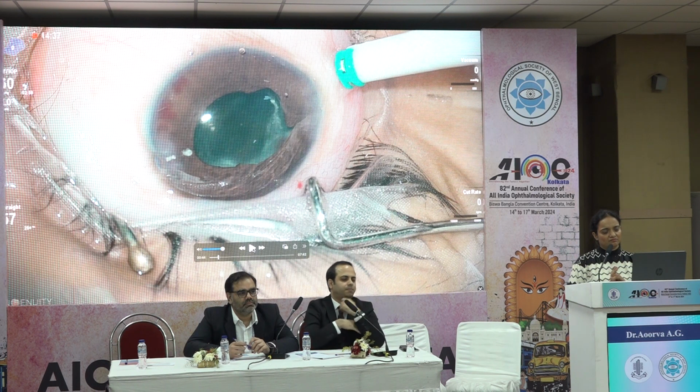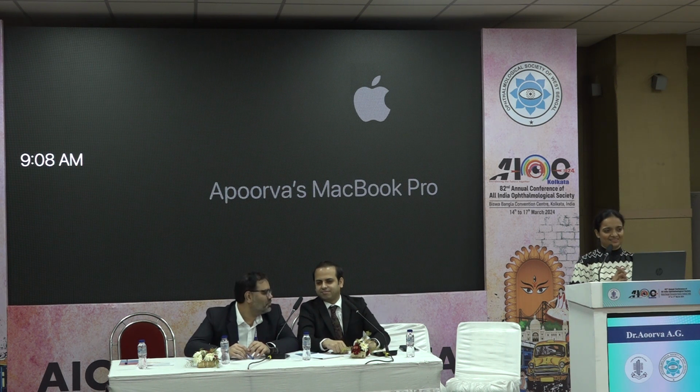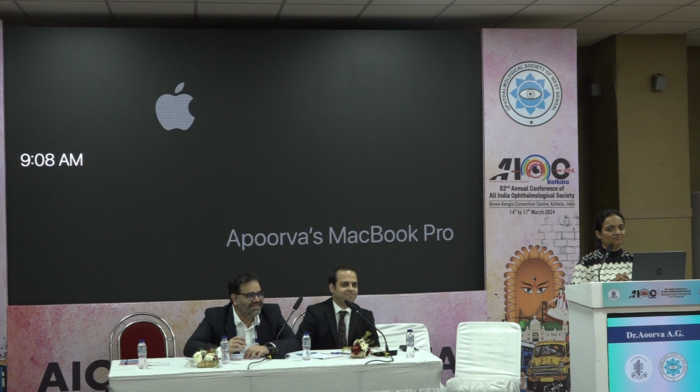And regarding that stalk, you did correctly not to try to avulse it. Otherwise it would sometimes have been catastrophic. In diabetic retinopathy cases we are sometimes successful in doing that, but here it is very dangerous. When you have such a closed funnel RD, the color Doppler is positive only, no?